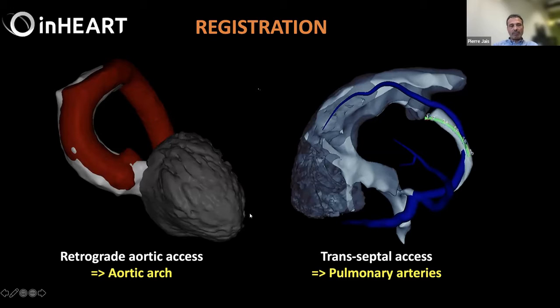It's in fact more precise with the ablation catheter because you don't have the uncertainty that you may have with the PanTray, where the magnetic sensor is in the shaft and then you have localization of the electrodes that is based on impedance. So I like better doing it with the ablation catheter itself.